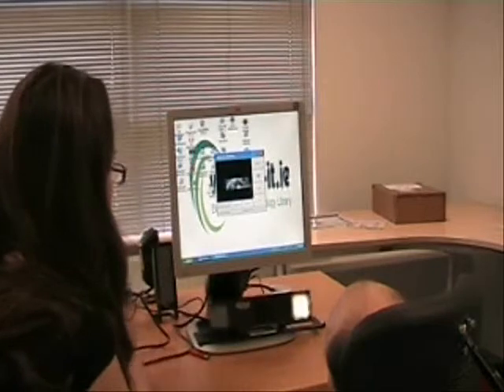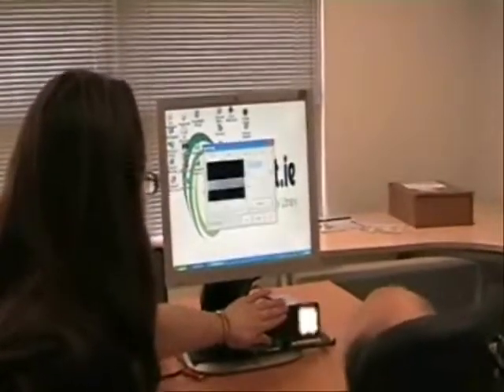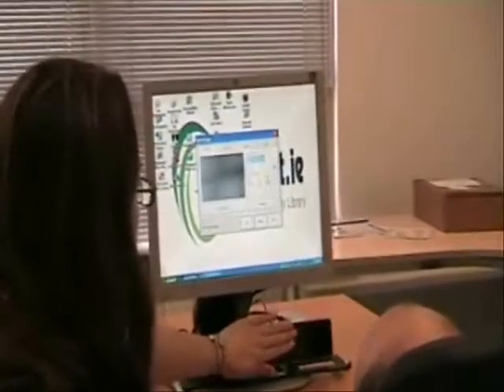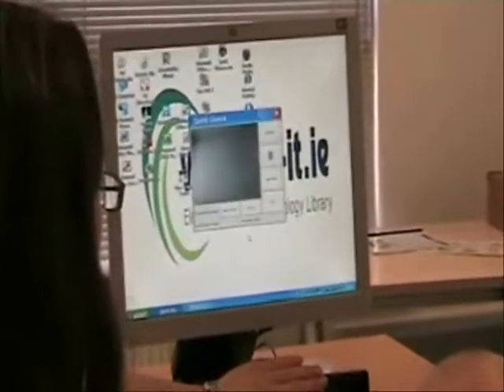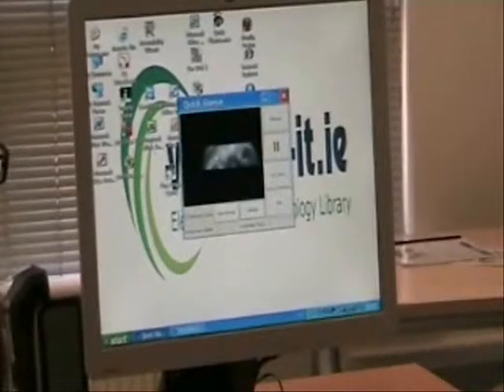Okay James, so after doing that calibration, I'm just going to check the settings to see how good your scores were. We've got a 9.2 and a 6.8, so those are both acceptable. We'll go with those targets as the calibration for you.